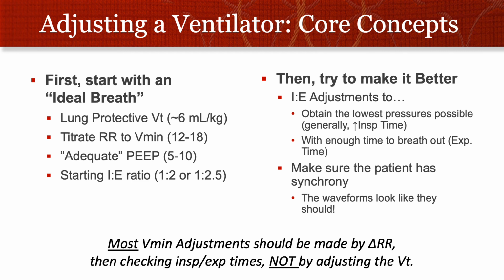And then I look at the inspiratory times and I make sure that I have enough inspiratory time that it's not a rapid, quick breath that needs a lot of pressure to get to an appropriate tidal volume, but that I also don't have an inspiratory pause or extra time spent in inspiration that I don't need. And I look on the flip side at expiratory times to make sure there's no air trapping and to make sure that the patient breathes out all the way with a tiny bit of extra time just in case they have some wheezing. I have a little bit of a safety margin.